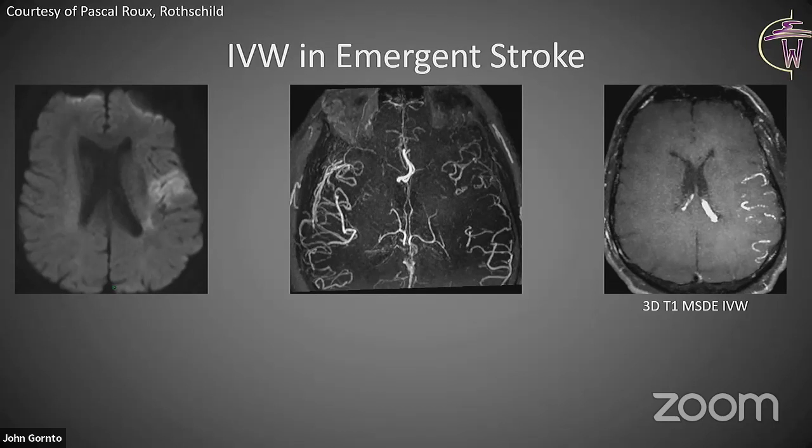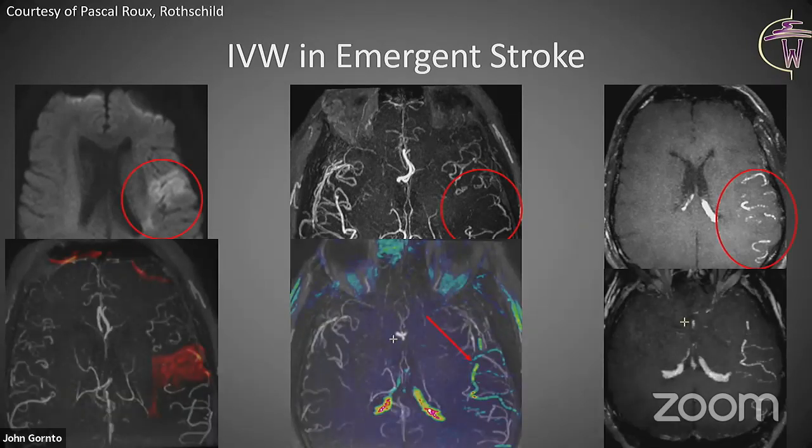You can see that everything is suppressed, except for, in this technique, those arteries that are occluded. You can see right here, there's this paucity of arteries in the left MCA territory, and that's exactly matching up with the area of enhancement. And just to superimpose the various imaging modalities, you can see right here, MRA was superimposed on the vessel wall technique. Those branches that are enhancing are all within that territory of loss of flow, in that territory of ischemia, with superimposition of the DWI and the MRA here.